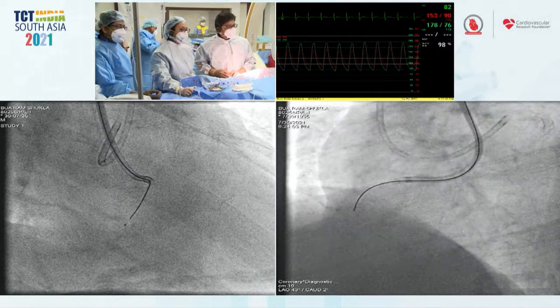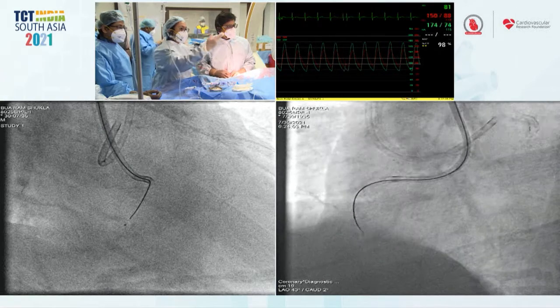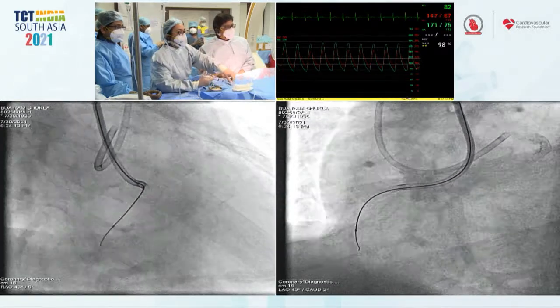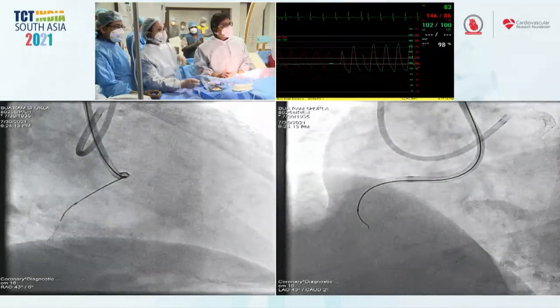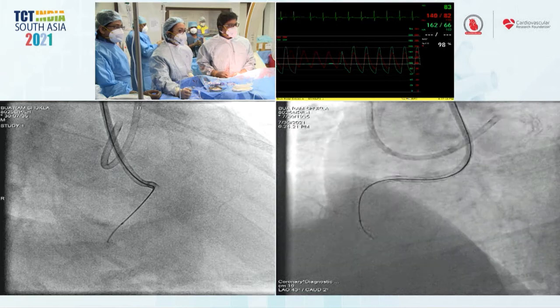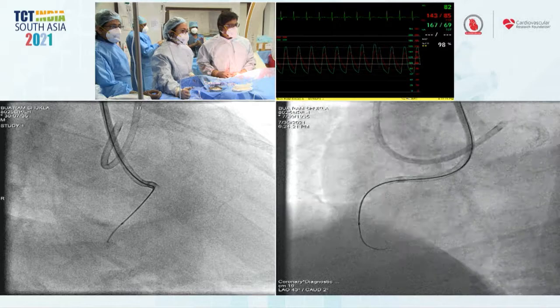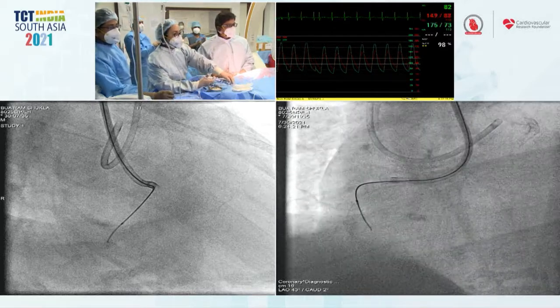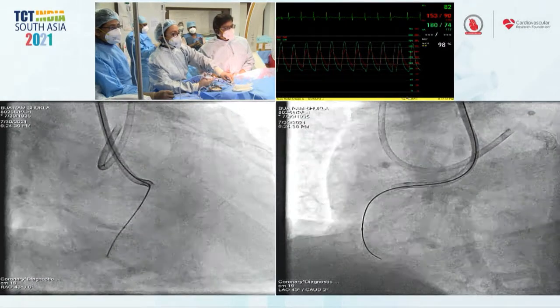I would be very judicious about how much work we do here, because you're in a beautiful spot right now to bring a Stingray down and try to re-enter. I agree, you should be judicious about not enlarging that subintimal space by spinning lots of wires into it. Actually, additional to that point, if available at some point, I'd probably jam a guideliner down the artery to try and limit inflow to the subintimal space at the moment we decide we're going to convert to a re-entry approach.